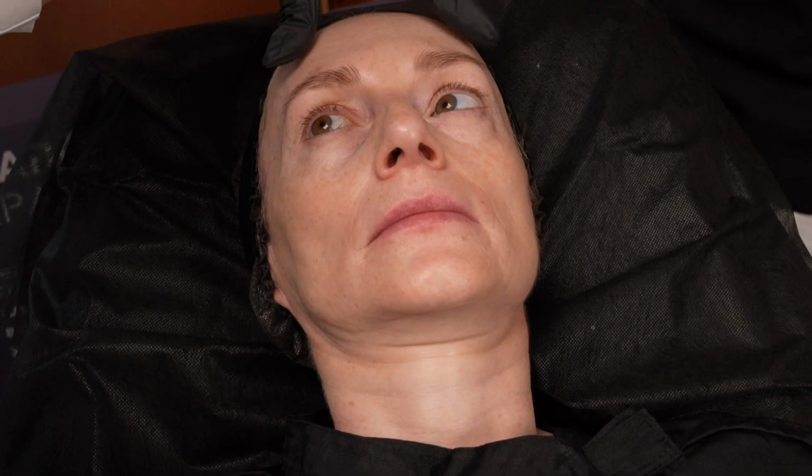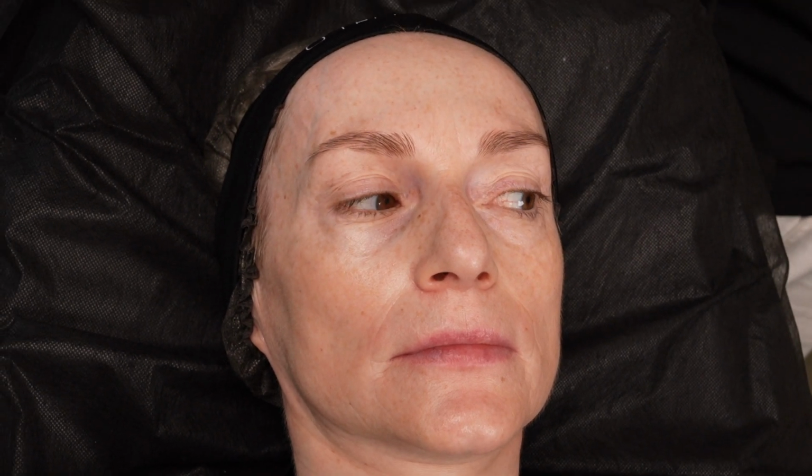Вы не делали ботулотоксин? Вот доктор рекомендует вам с этого начинать. If you want, I can show a little bit this frown lines also, with the blanching technique, because it's one of the afraid area. I can show it. So let's start with the temple.